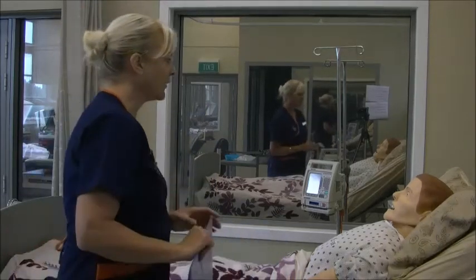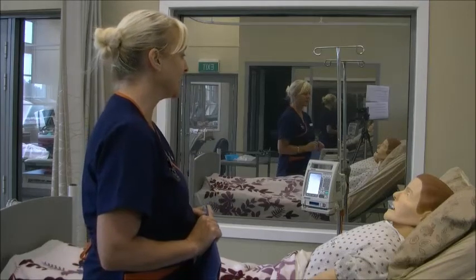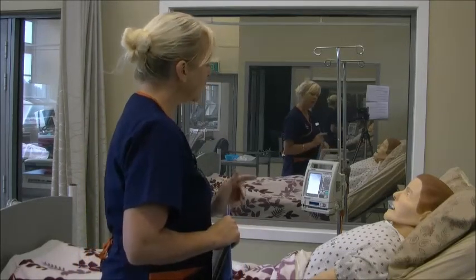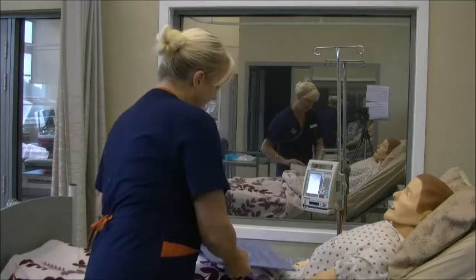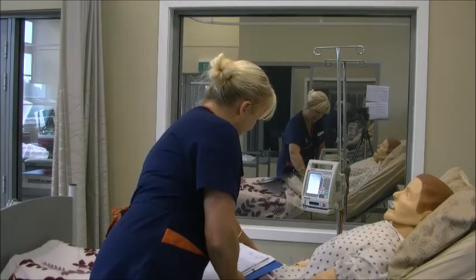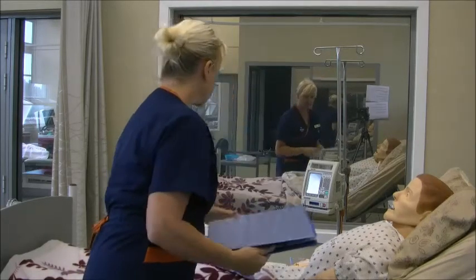Hi George, I'm Andrea. I'm your registered nurse that's looking after you today. I've just come in to do a quick assessment and then put some IV fluids up, which the doctor has asked me to do. If you can just confirm to me what your name is. So I'll look at his ID card, his ID band and match it up with the chart and his date of birth and his NHI number. So that's correct.